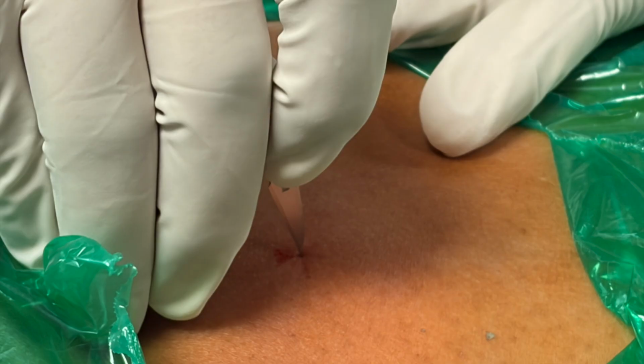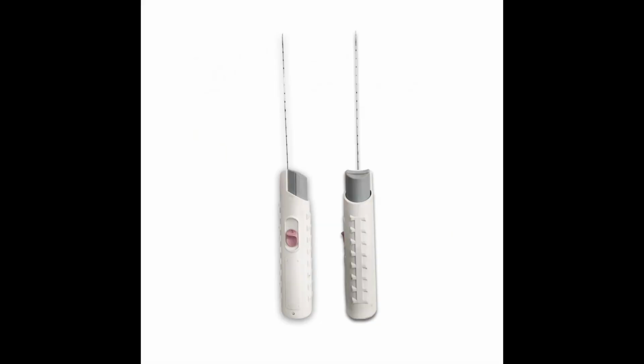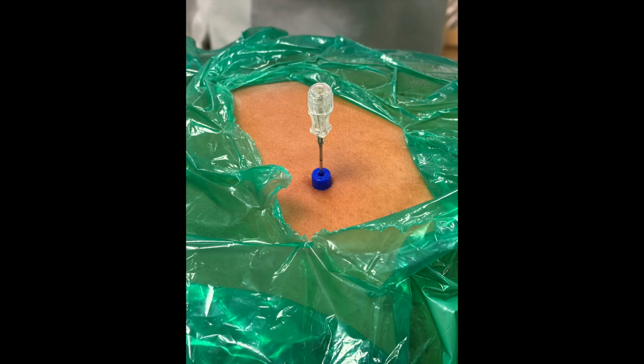After that, we will be using a coaxial needle, that is the one shown on the screen. And once you remove the stylet of this, we will put an automatic biopsy gun through it. So in this case, we'll be using an 18 gauge automatic gun with 10 centimeter length and a 2 centimeter throw.